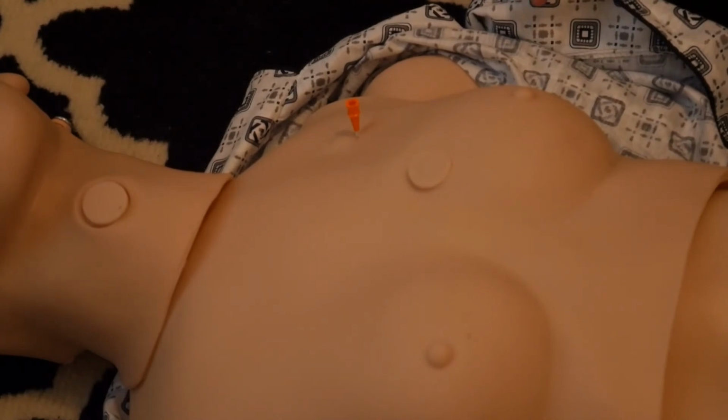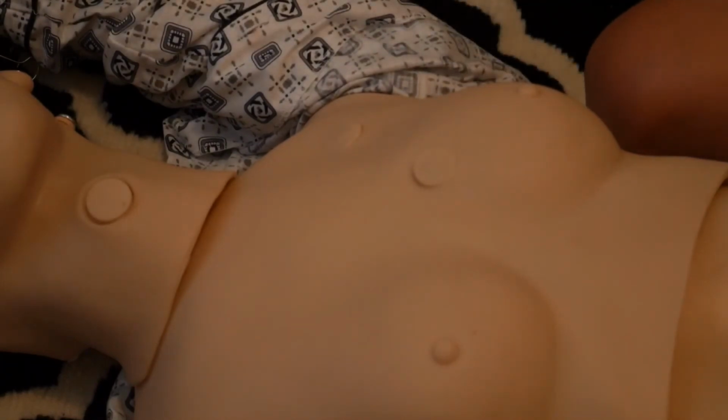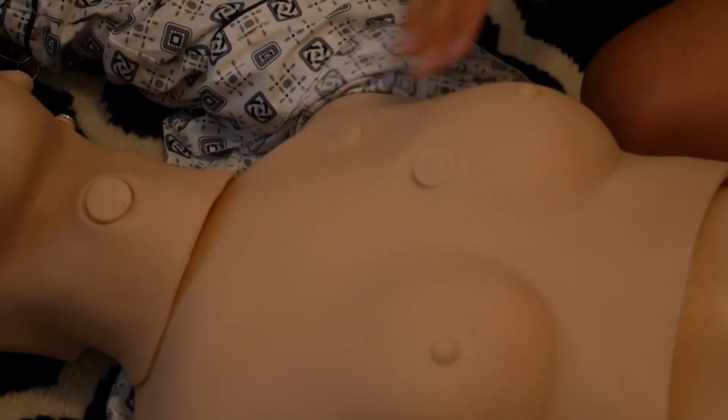You should consider doing another needle decompression if respiratory distress has not improved, there was no increase in oxygen saturation, and no return of consciousness or a radial pulse. Those signs may indicate that you failed on your first attempt. Okay, so pretend the first needle decompression did not work. The needle hub is still there on the site.